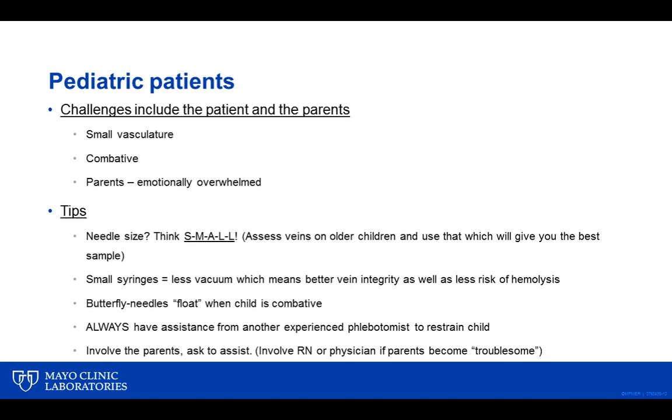I think sometimes we get into stereotyping our patients and we automatically say, oh, this is a peds patient, so I'm going to use a tiny needle, without actually looking at the vessel itself, because as you know, the larger the needle we can use, the better the quality of the specimen will be. So although I do advocate small, don't hesitate to use a larger needle, even a 21 if you're looking at an older child with great veins.